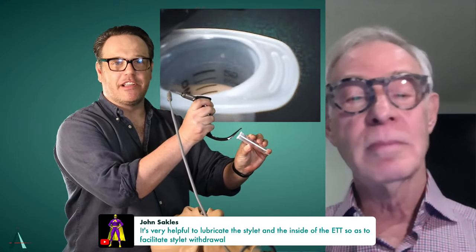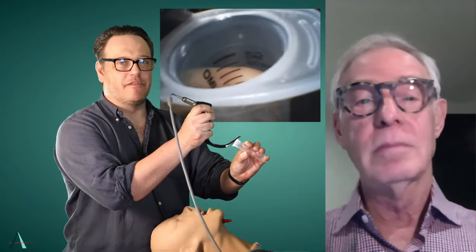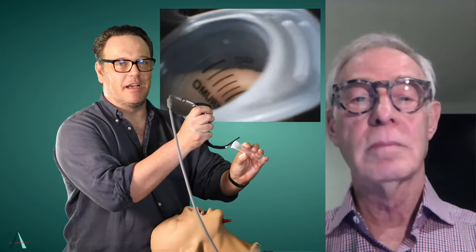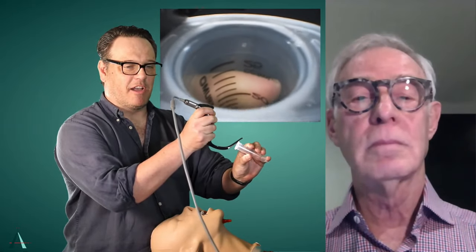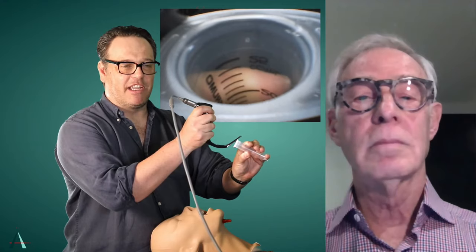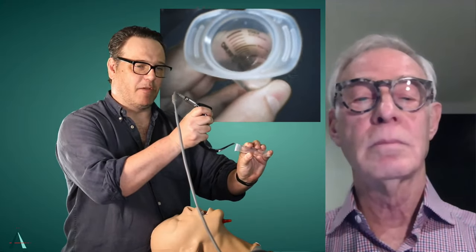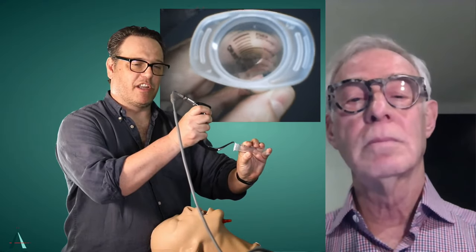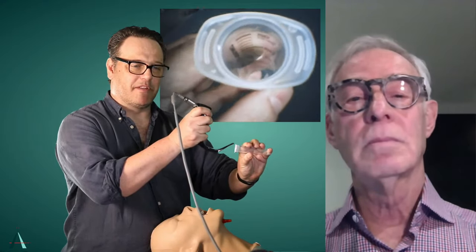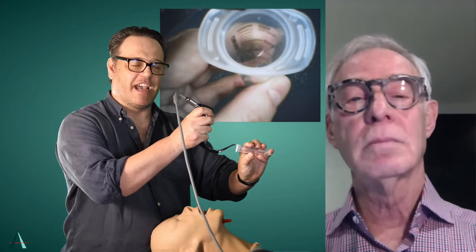Well, I'm honored. Can I just say, with that close up view, can we just put the video laryngoscope screen up? If you imagine those numbers on the syringe are the tracheal rings. With that sort of intuitive view you go for, where you deeply engage the blade, what you're getting is a close-up view where you're looking up at the larynx, and between the cords you're seeing tracheal rings and the trachea is sort of filling the screen. By doing what Richard's suggesting and really keeping your blade back here, what you're getting is the larynx in the upper half of the screen. You may have a sort of compromised view with a bit of epiglottis dropping down, giving you a grade 2 view. But you're looking more down into the larynx and seeing more of the axis of the trachea.